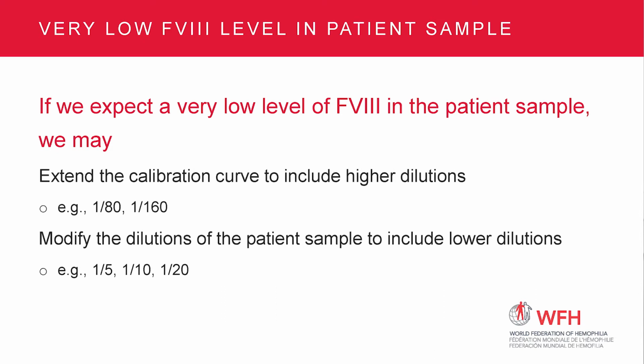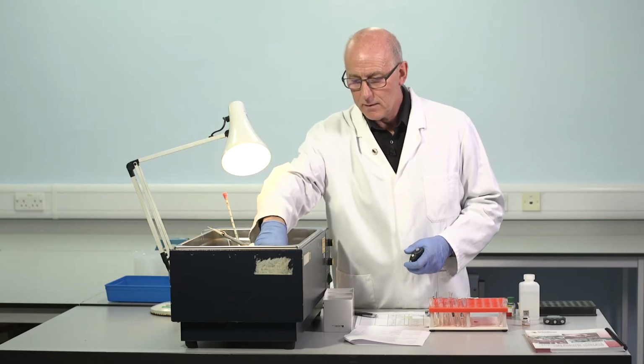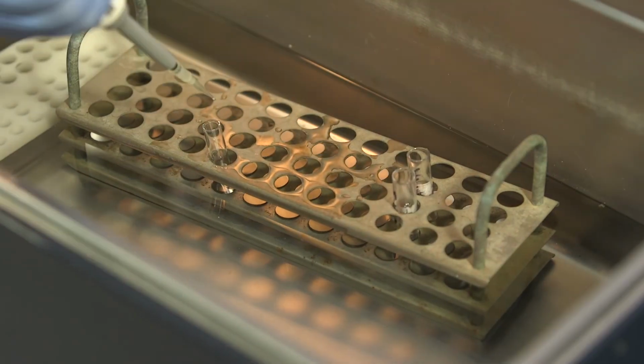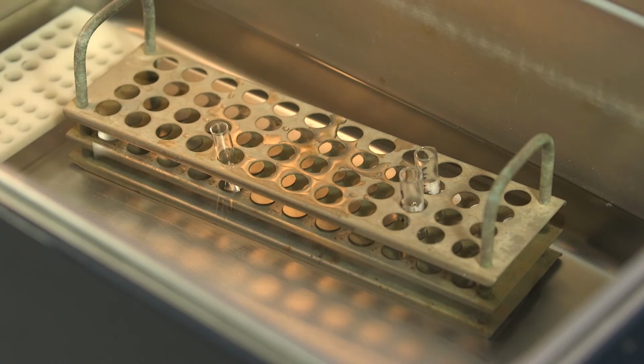The second is we can modify the dilutions of patient sample. So instead of 1 in 10, 20, 40, we might choose instead, where we expect a very low level, 1 in 5, 1 in 10, 1 in 20. 3 minutes, calcium to this buffer blank tube.